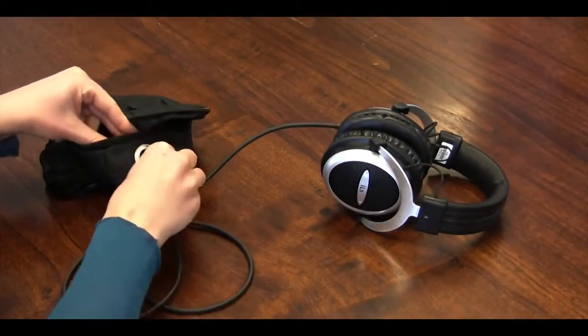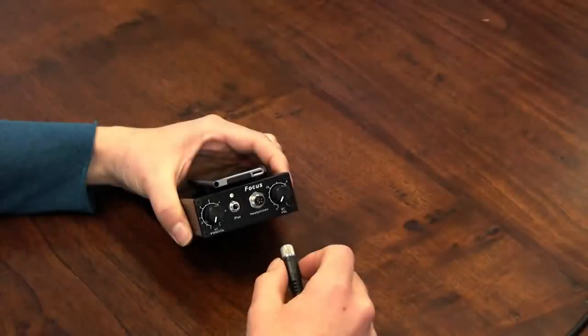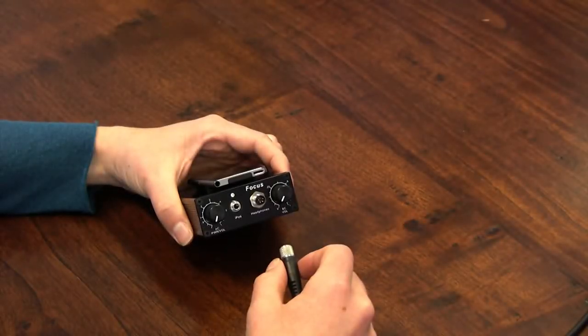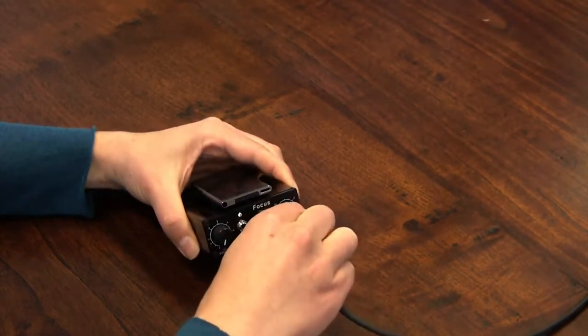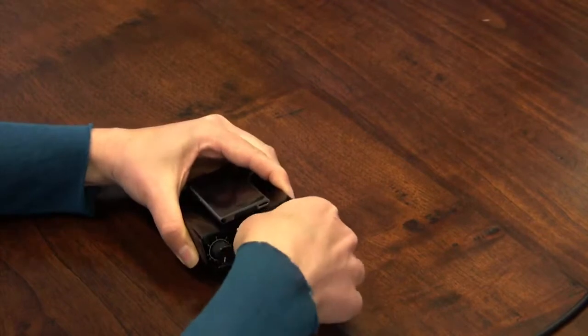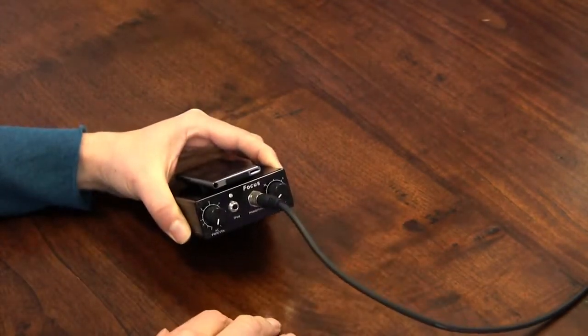Let's connect the headphones. Take the headphone cable and run it through the grommet on your waist pack. The headphone cable is designed to screw down securely to the amplifier. Line up the 4 pins on the connector with the 4 holes in the cable. Plug the cable firmly into the 4-pin connector and then turn the silver collar clockwise until it is snug.